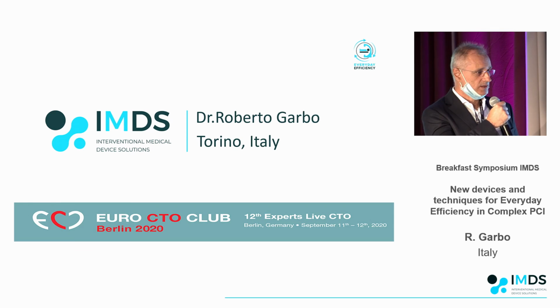The device has very high penetration capacity, and in the septals there is a benefit because they're such small vessels that the device cannot deflect laterally. It's by default restricted by the muscle to keep all its penetration power forward. So it helps. Exactly, because the vessels are so small. Yeah, this is an important point. So thank you very much. Thank you.